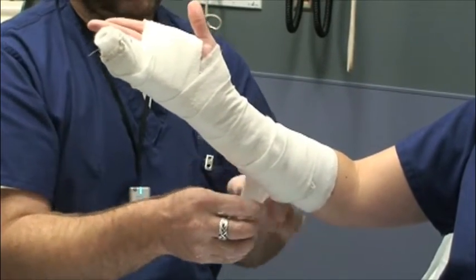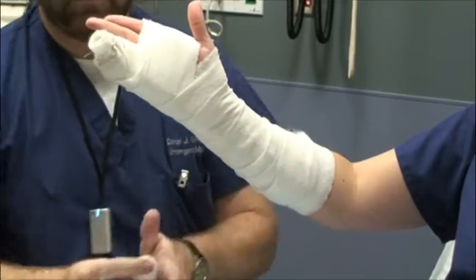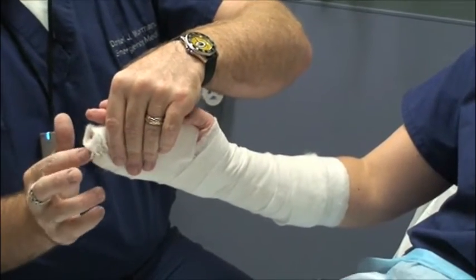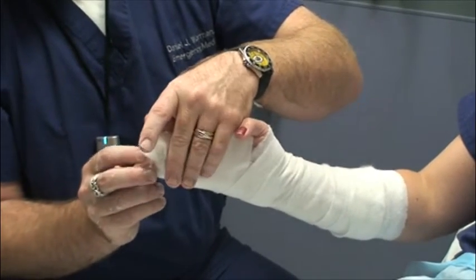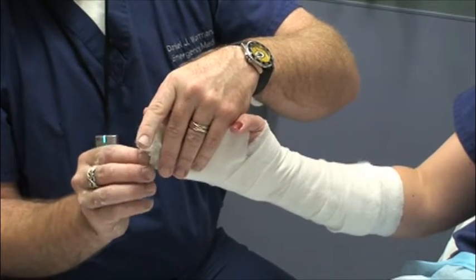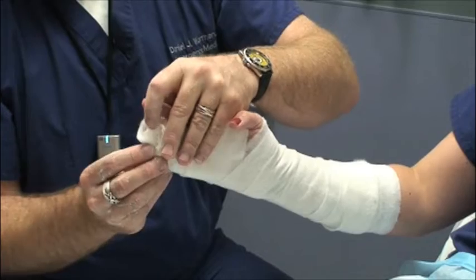Mold the edges so that they don't seem like they're going to cut anywhere. For splints that you have to mold, you may want to use not-so-hot water because it gives you a little bit more molding time. For splints that don't need much molding, you can use hotter water as it will set a little bit faster.